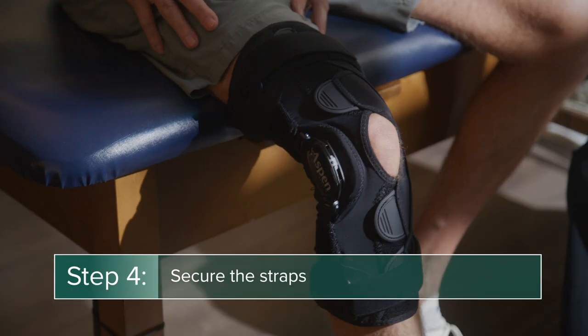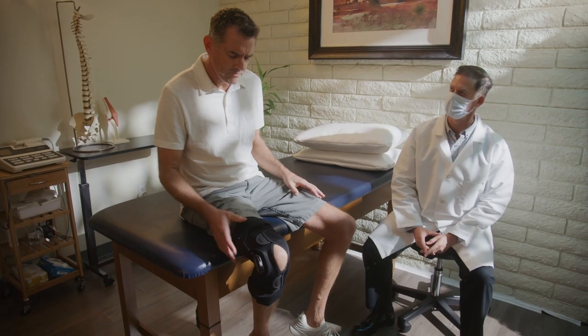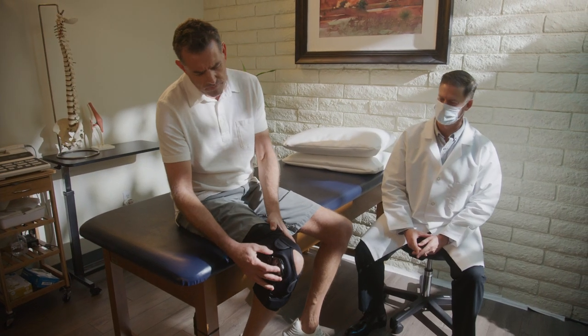For comfortable wear, adjust and tighten straps as they are secured into place. Be sure not to over-tighten, as this could lead to injury or discomfort.